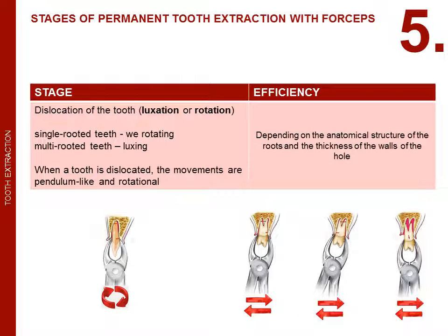Dislocation of the tooth: luxation and rotation. Depending on the anatomical structure of the tooth and the thickness of the walls of the socket, you will do either luxation or rotation. Single-root teeth, we rotate. Multi-root teeth, we luxate.